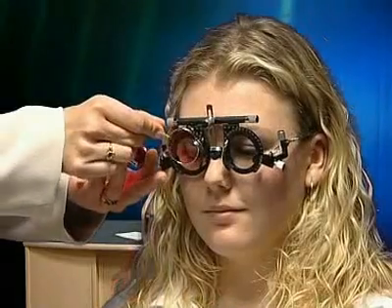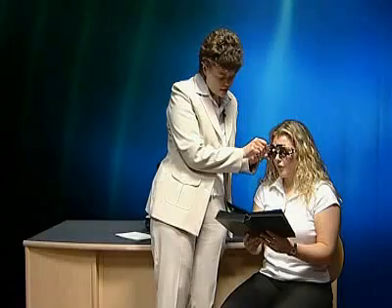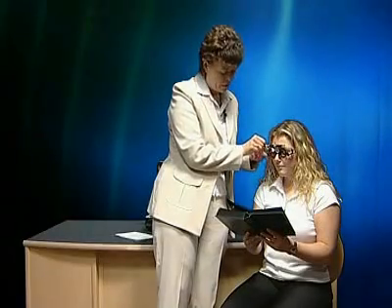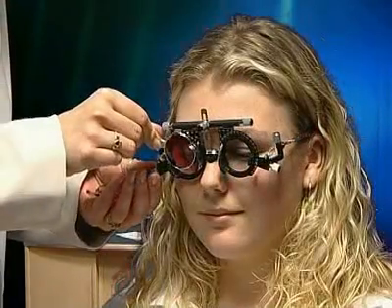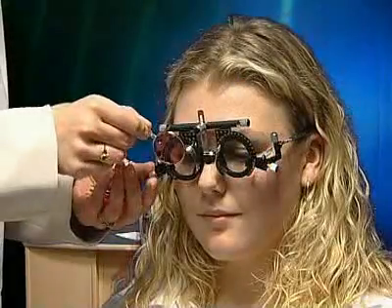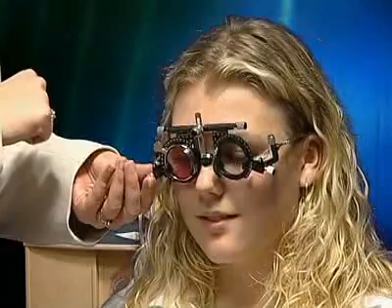Looking through the filters one by one, Zara reports no difference with several of them. Then, with one particular filter in place: Yes — that's better. We have found the filter that works for the non-dominant eye.